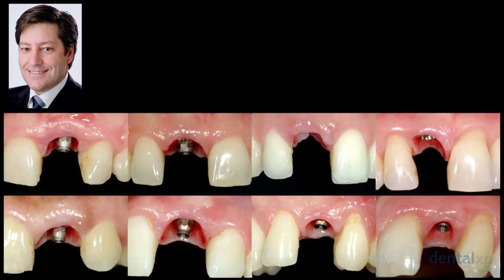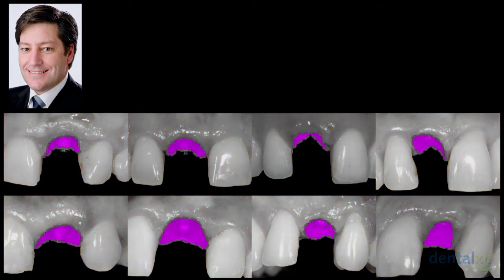The same from the buccal aspect. You see the same 8 cases here. And if we make abstraction of the color, you will see this is even more demanding here. Some of them are in a semi-lunar way. Some of them are more rounded. Some of them are more squarey. But this is kind of the way you handle this emergence profile.